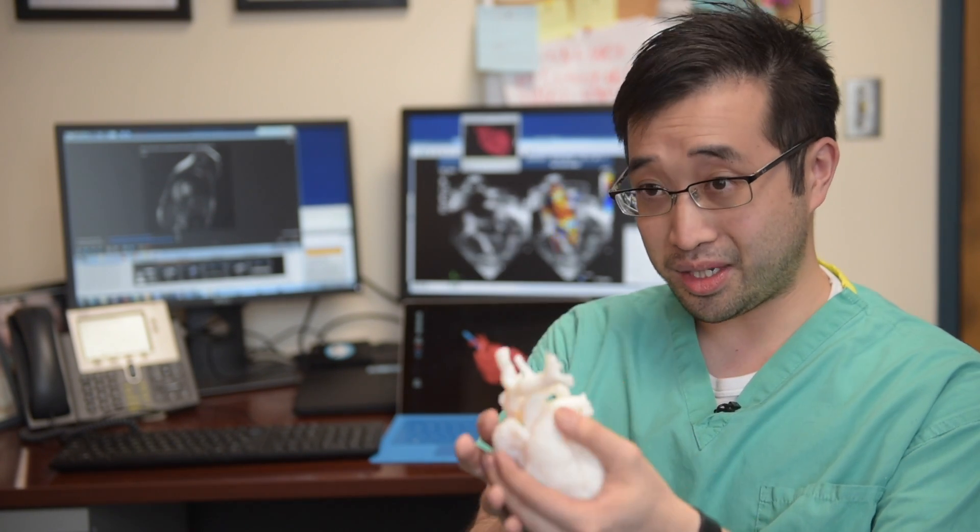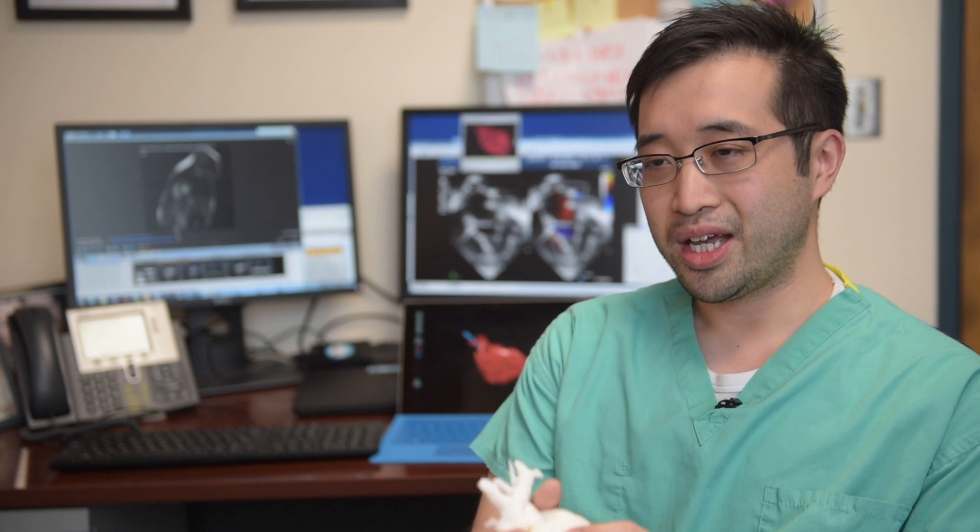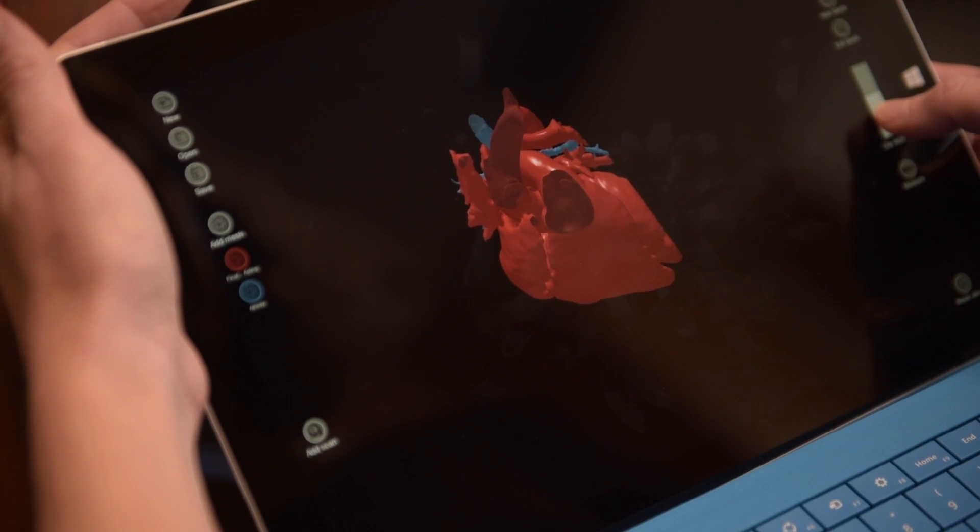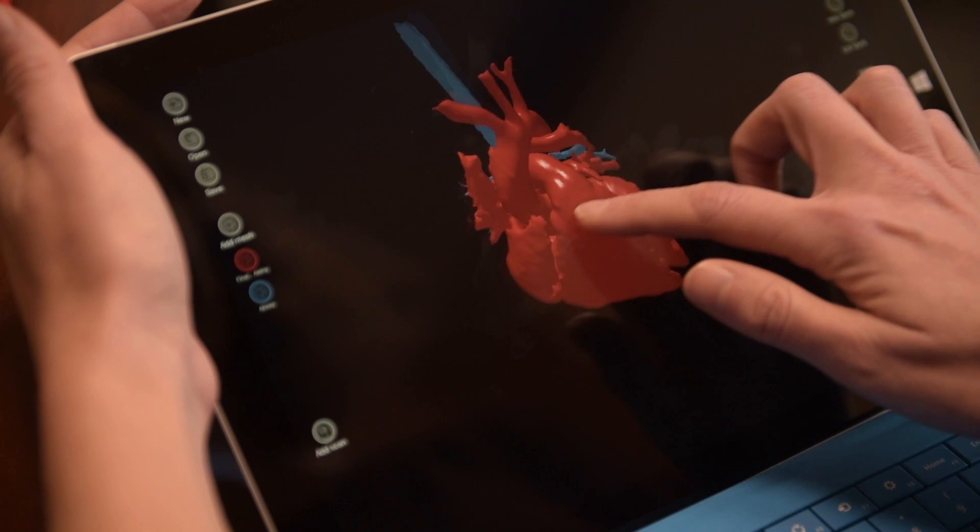So instead of spending several hours or actually half a day getting this printed out, we'd be able to import the 3D models onto a tablet and bring the tablets to our fellow colleagues to show them the specific congenital heart disease.